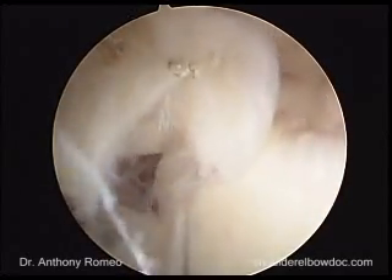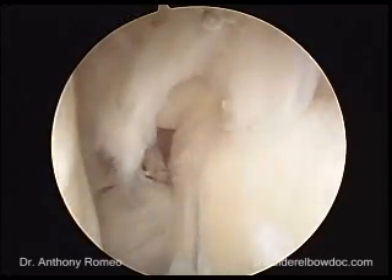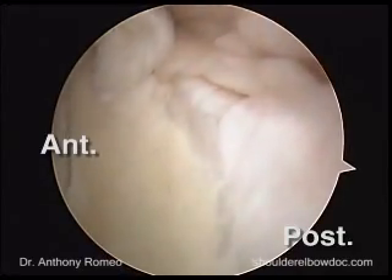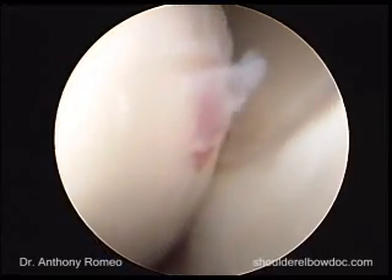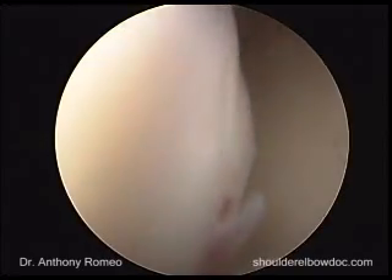We then look at the other structures of the shoulder to do a thorough examination. We'll look at the posterior labrum, and this patient has some osteophytes that are already developing, consistent with osteoarthritis. We'll look down the back of her shoulder and into the back compartment of the shoulder joint.